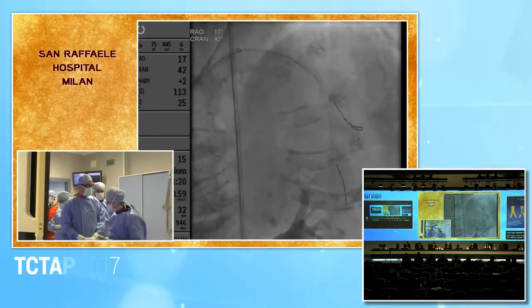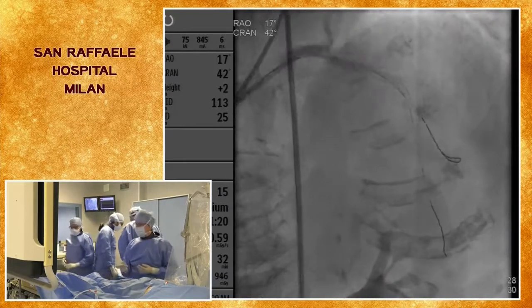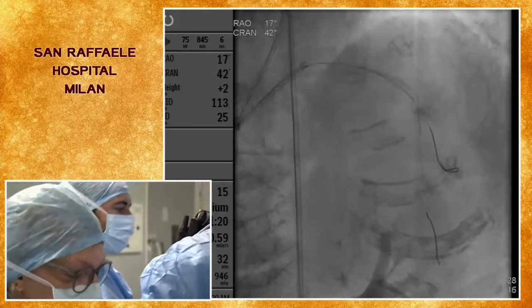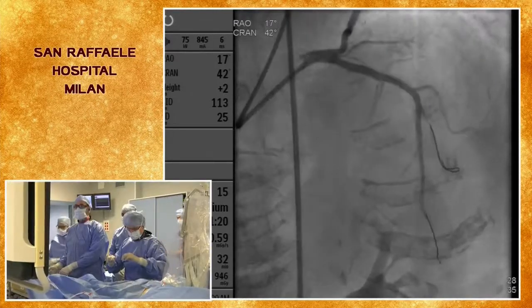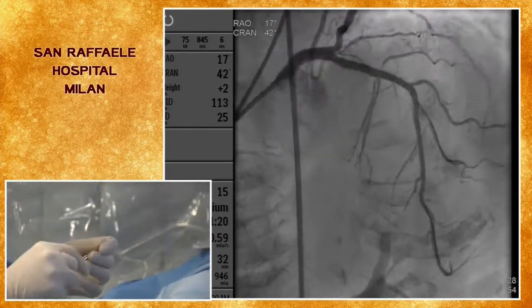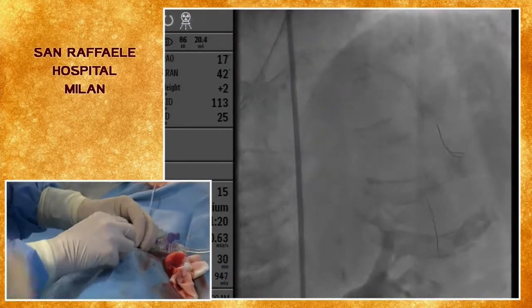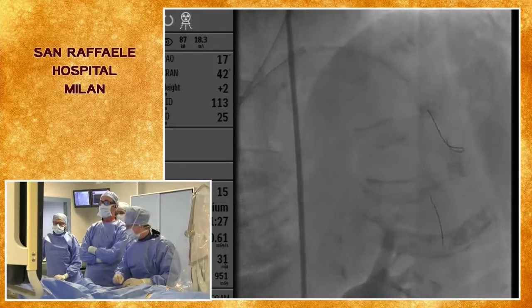Let's take a universal wire. Can I have a new wire? We also have a Fielder open. Okay, we have a Fielder open. Let's use the Fielder. Abbiamo una Fielder già aperta. We have a Fielder already on the table. So we're going to go with the wire, not because, as Yves said, we want a stent, but because we may go with the balloon. I always like to finish the case with the same number of vessels we started, including side branches. So if it's possible not to lose any side branch, it is better. As Lorenzo said, we have a stiff wire in the diagonal, so maybe we are dealing also with some spasm.